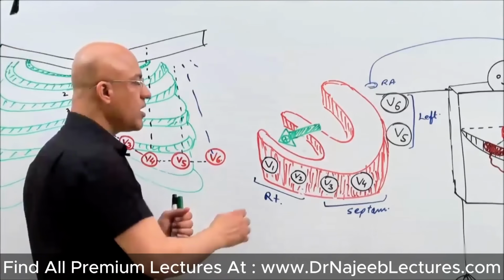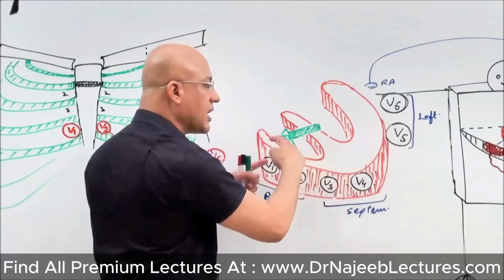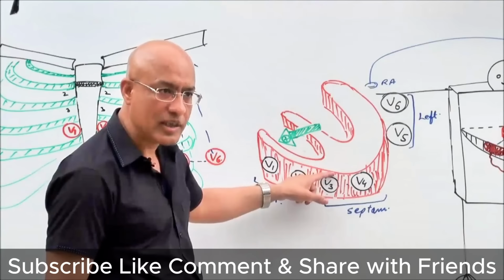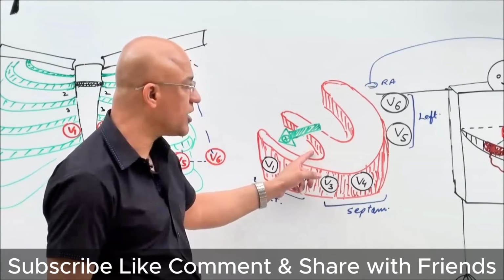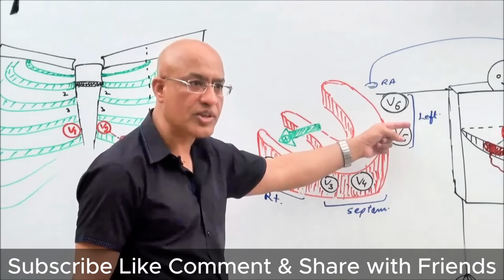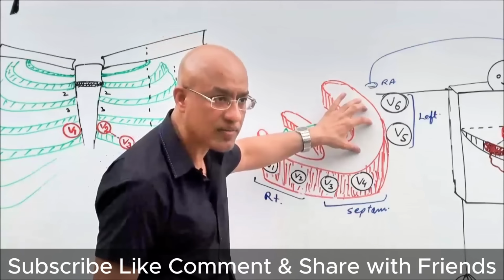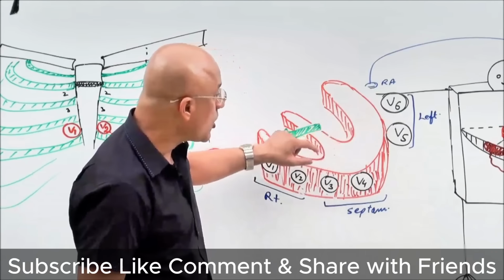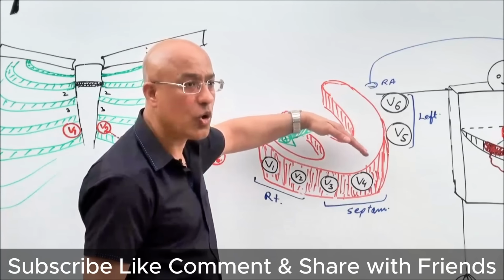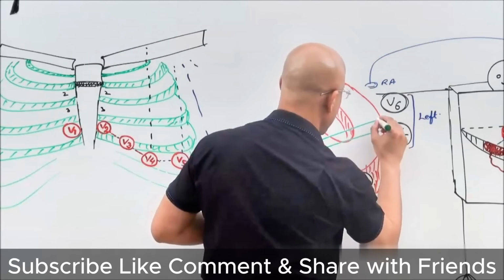And after that, once the septum is almost depolarized, major part of both ventricles undergo depolarization. Right ventricle undergoes depolarization rightward, and left ventricle undergoes depolarization left side in the horizontal plane. But because left ventricle is thicker, the common vector of major ventricular depolarization is oriented towards the left. Now what is this vector? Left and little backward.